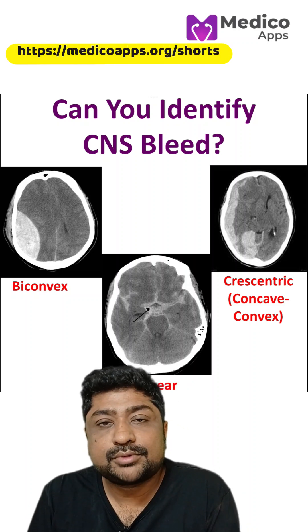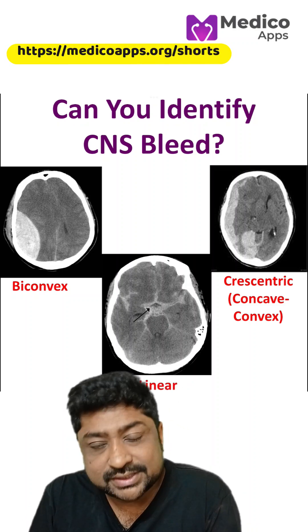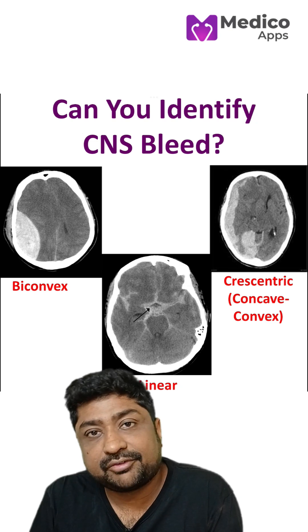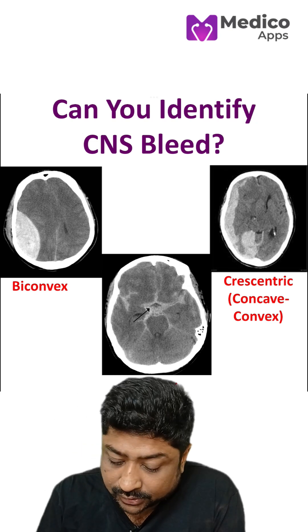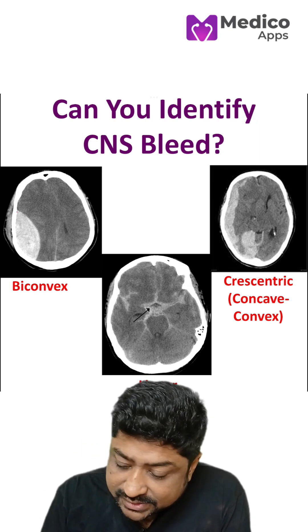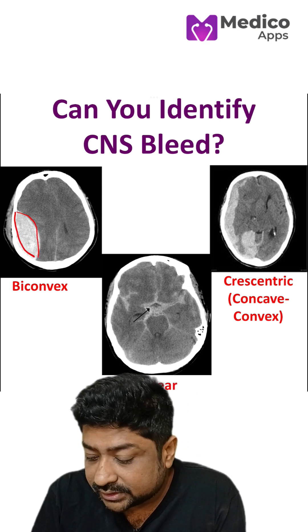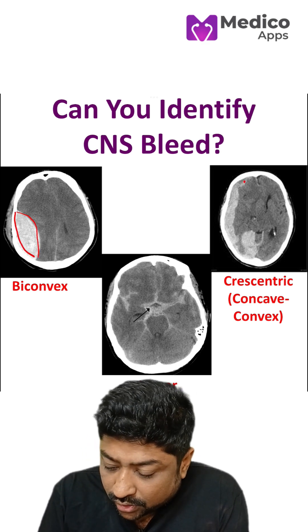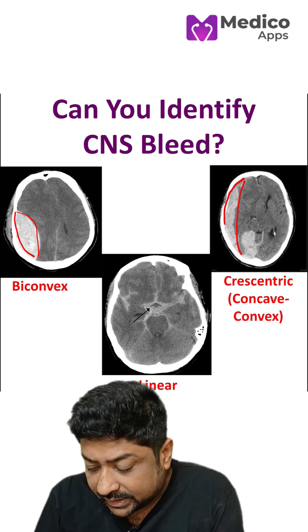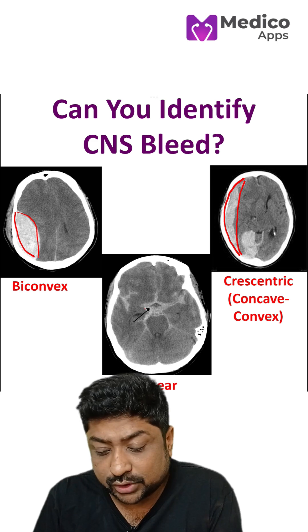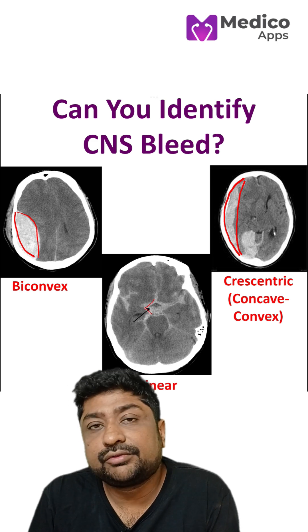Very frequently in your exams you will be shown a CT brain and you will be asked to identify the type of the bleed. So there are three images which we are seeing here: one is having a biconvex bleed, one is having a concavo-convex or crescentic bleed, and the third is basically having a linear bleed. So let's look at each one of them one by one.